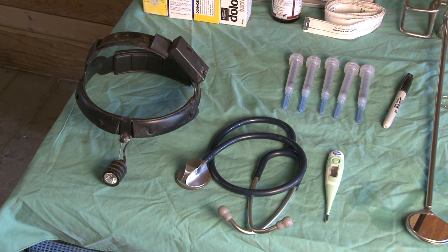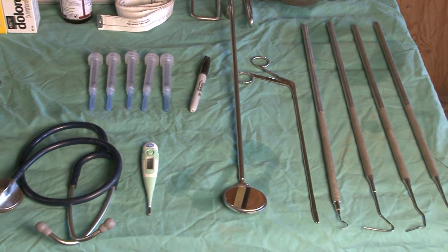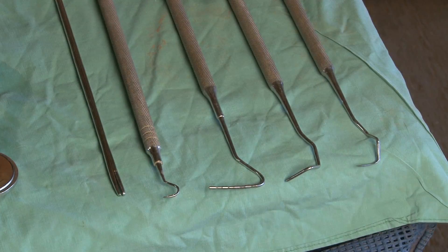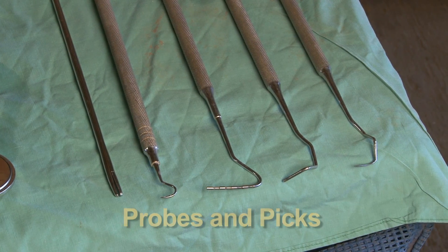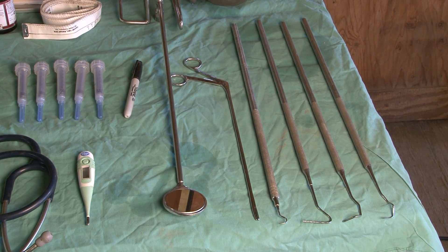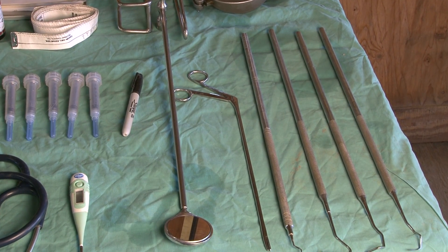And then we continue with the oral cavity, and the instruments that you'll need for that as a minimum is a dental mirror. We have a dental explorer, probes and picks, and long-handled alligator forceps for removing foreign bodies. And these are going to be used on almost every exam you do.